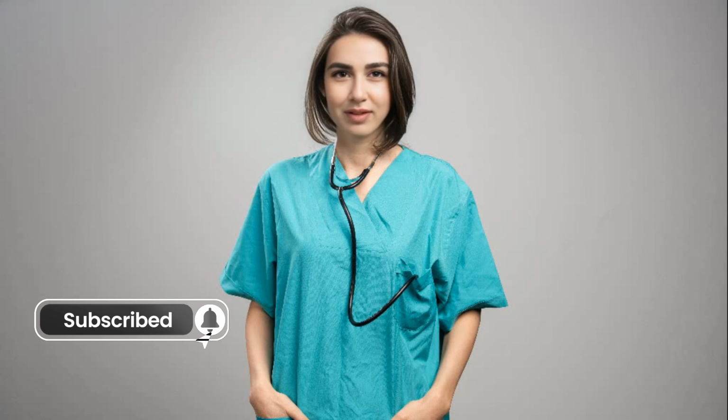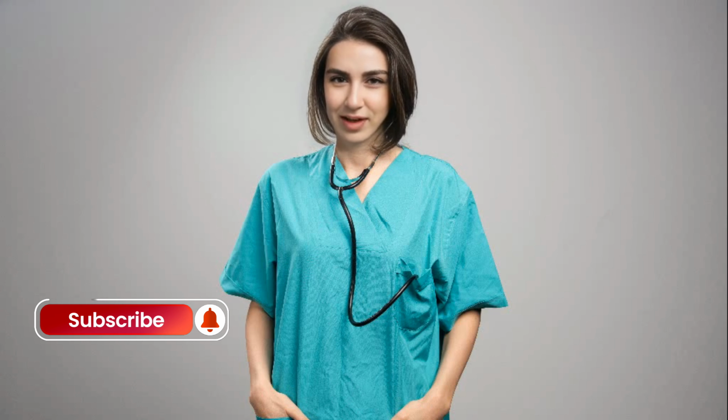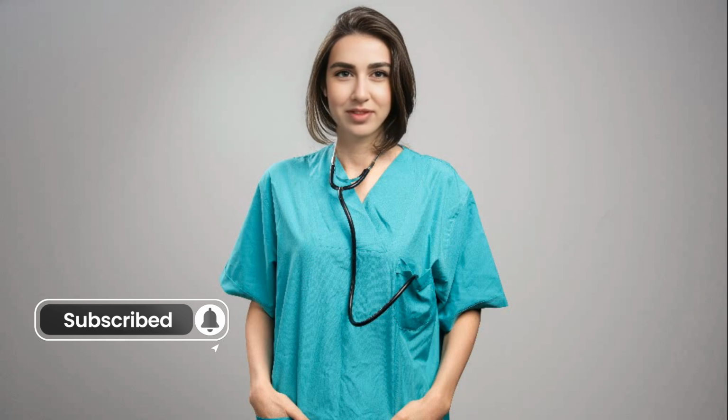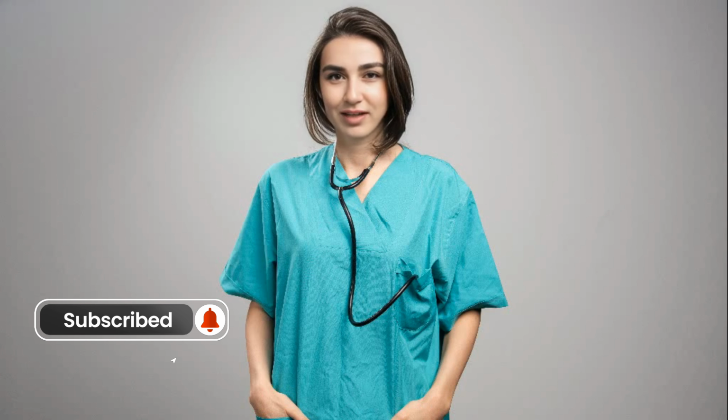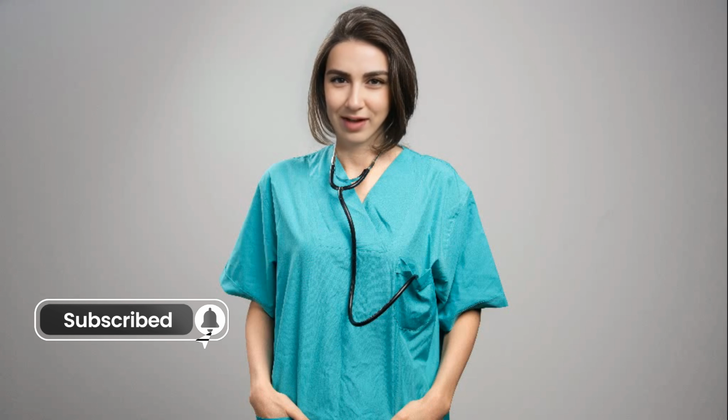Soft plaque. Angioplasty is generally more successful when dealing with softer, newer plaque. Calcified or hard plaque. Older, calcified blockages may be more challenging to open with a balloon and may require additional techniques, like rotational atherectomy, a procedure that drills through calcified plaque. 2. Location of the blockage. Blockages in smaller or more complex arteries, such as those with multiple branches or sharp bends, can make angioplasty more difficult. Blockages in larger, straight arteries are generally easier to open with angioplasty.